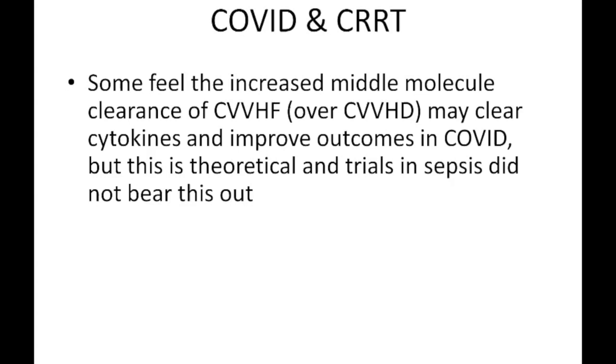And when this was studied, however, this middle molecule removal didn't seem to improve outcomes at all. And one theory for that is that just as there are pro-inflammatory cytokines, there are anti-inflammatory cytokines, and the dialysis machine is not smart enough to take out only the bad actors. And so it probably doesn't make a difference, frankly, which one you use. But based on this concept of middle molecule clearance, UVA, along with most other institutions, will be employing CVVHF as our modality of choice.